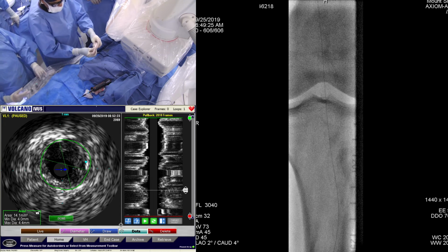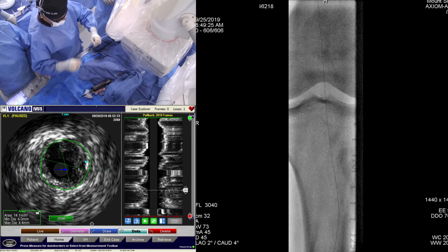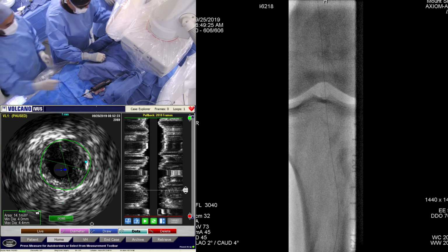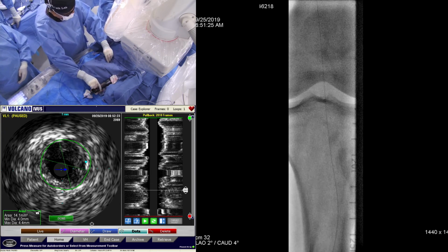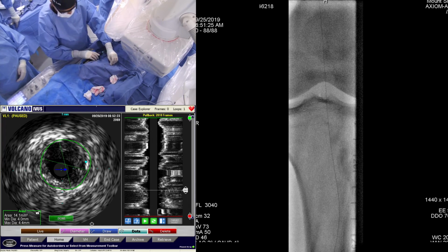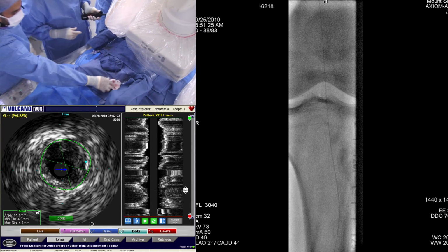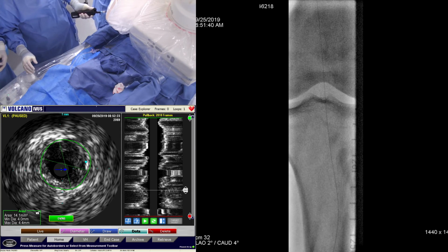So as you know, with the Supera, back to our point, fracture is not as much an issue with Supera as it is with other stents, the older generation nitinol stents. However, vessel prep is incredibly important, and I believe the Supera size is very important. We do not use the 4.0 Superas or 4.5 Superas because our restenosis rates are very, very high with those. So we tend to use 5.5s and up, some 5.0s here and there.